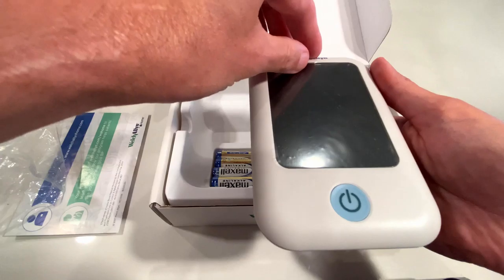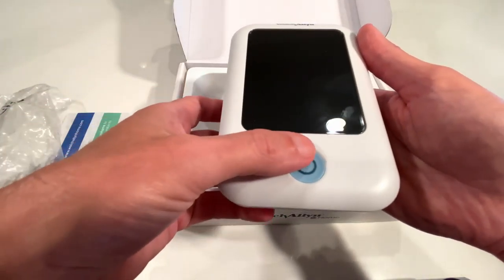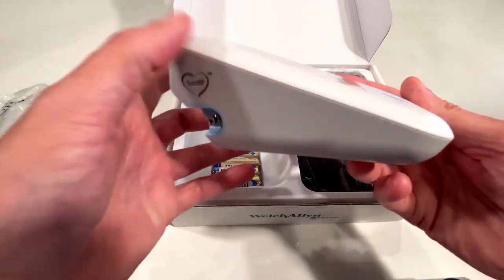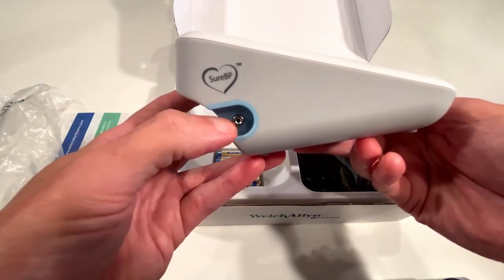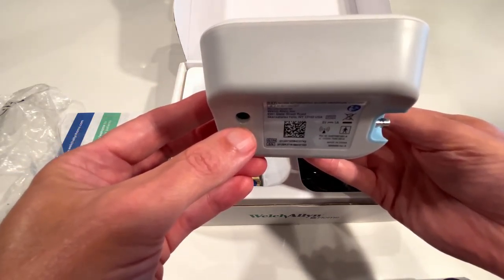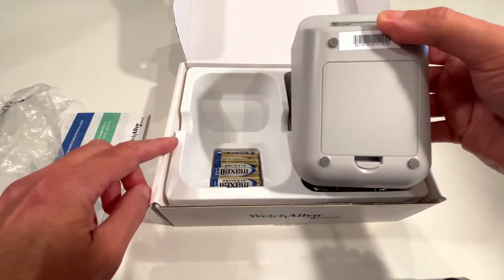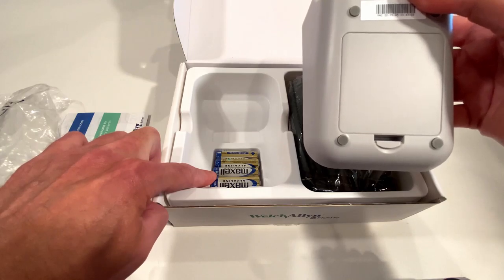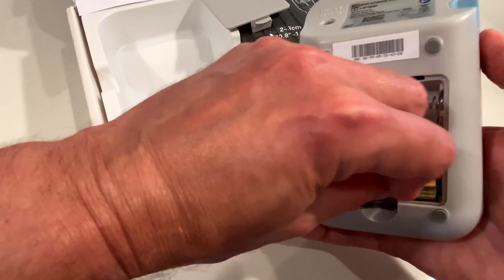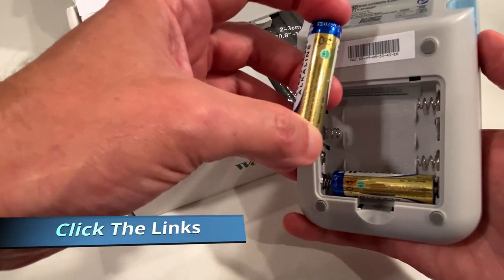It also has a protective covering over the screen that you can peel off and remove. This is the power button. On the right side there's nothing. On the left side you have the air supply tube connector, and on the rear you have the power cord adapter. On the bottom you have the battery compartment and it comes with four batteries, which they put under the monitor. The unit doesn't come with the power adapter, but it can be purchased separately at any time — I've included a link down below for that and the unit itself.